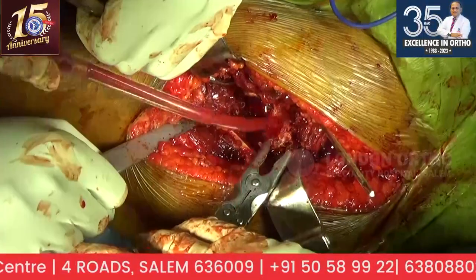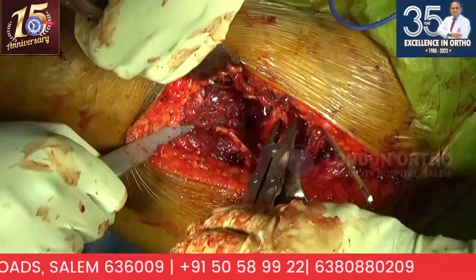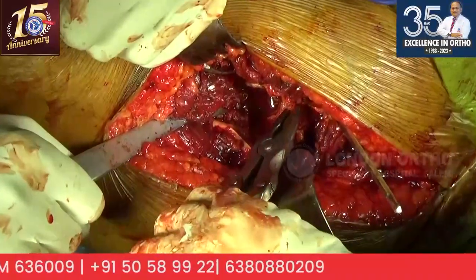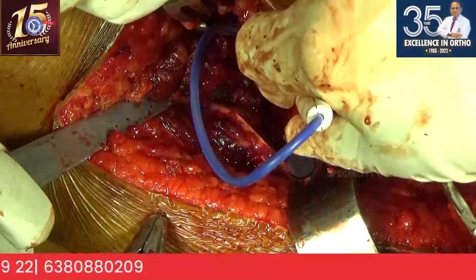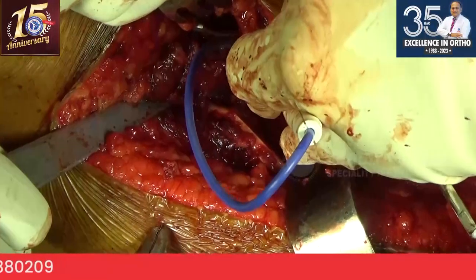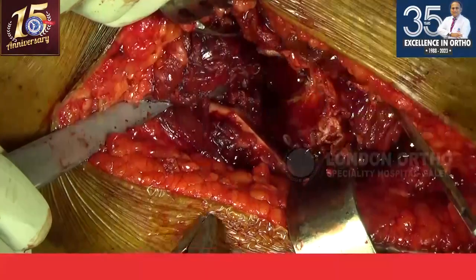So that depression is not the true floor. Sorry? That depression, what we are able to see, is not the true floor of the acetabulum. This is the point, no. The true floor is here. So you have to go up to that floor, sir.